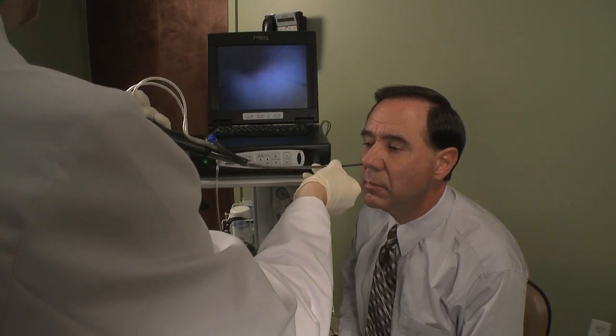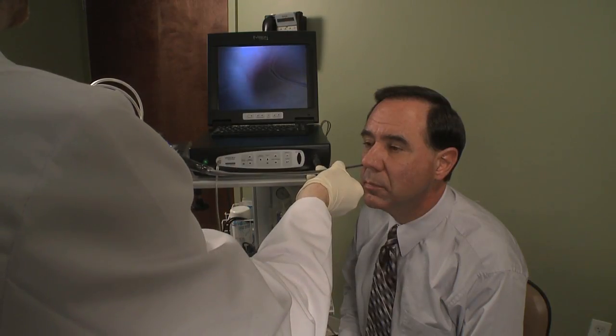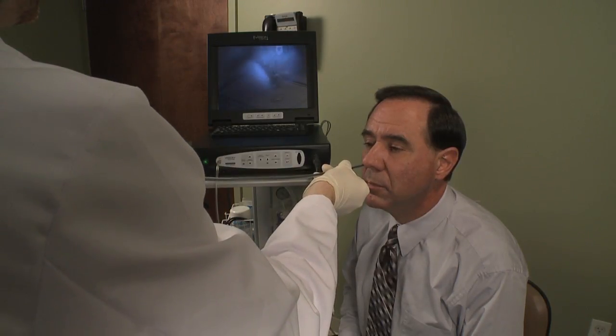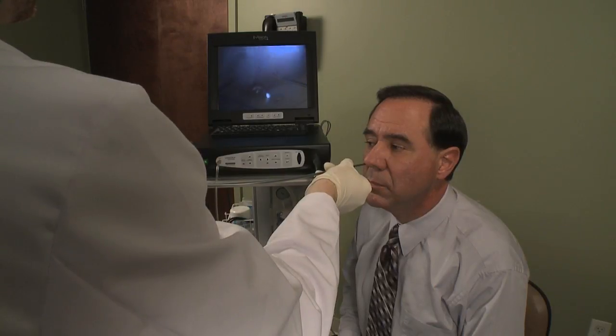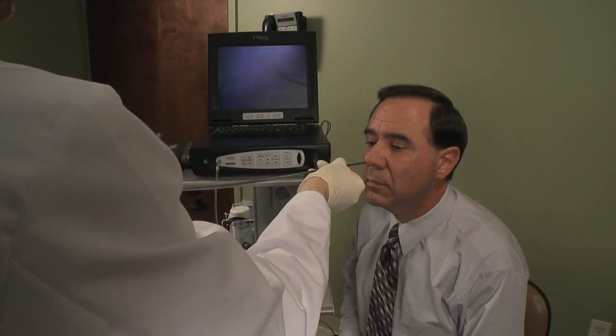When the exam is complete, slowly but steadily withdraw the scope from the patient. During removal, ensure the endoscope does not come in contact with the vocal cords or epiglottis and does not rest on the cricoid pharynx area.